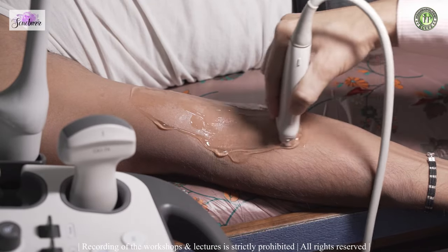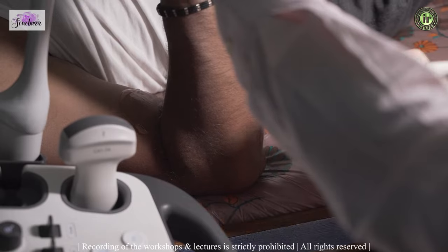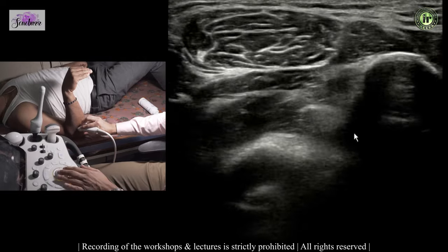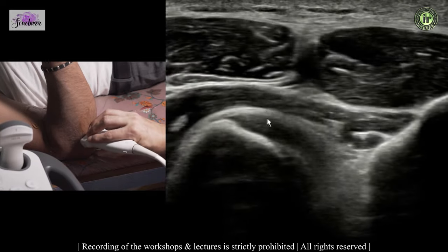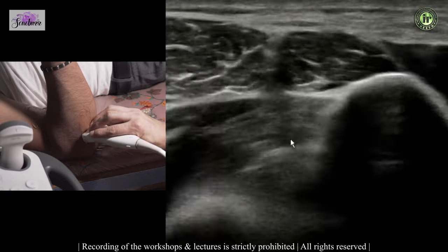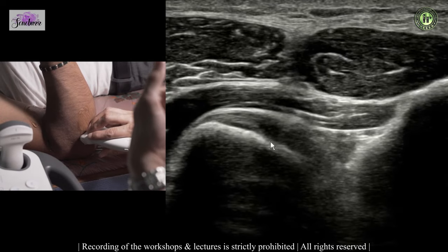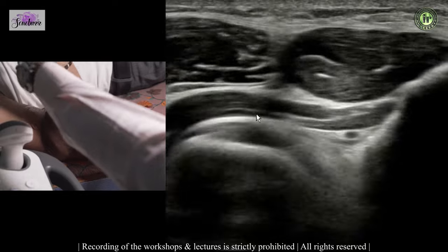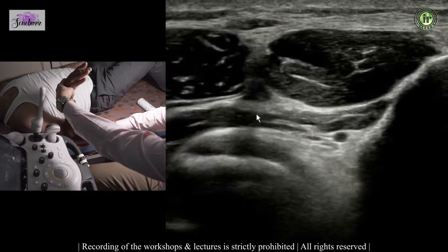Another way to see the distal biceps tendon is the cobra maneuver: flex the forearm at the elbow and keep the probe transverse in the upper forearm to see the radius and ulna. Decrease the depth for a better view — that is your radius and that is your ulna, and that is the footprint of the biceps. With pronation the radial tuberosity points more posteriorly, and on dynamic pronation-supination you can watch the biceps footprint move anteriorly on supination and posteriorly on pronation.